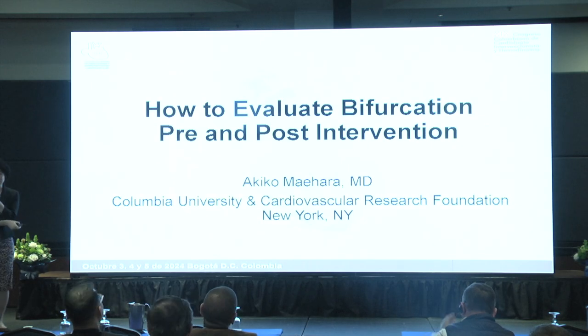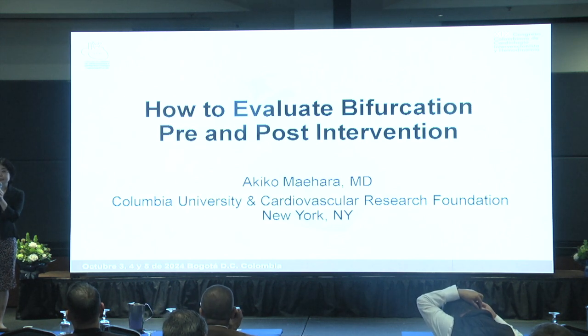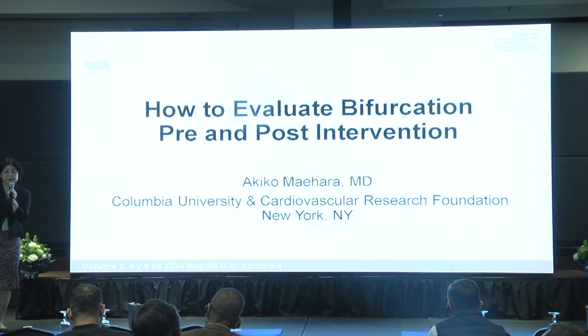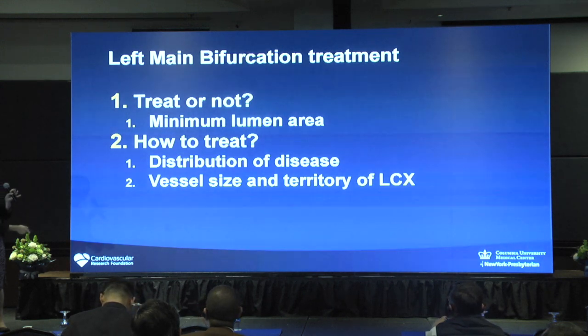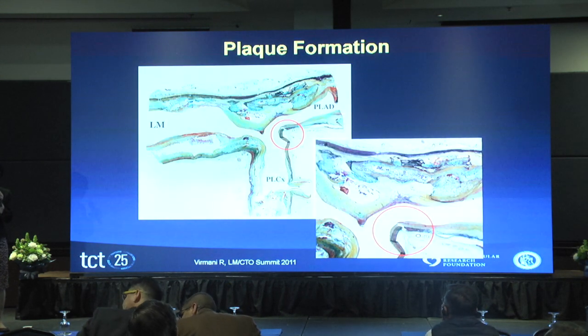This is talking about the bifurcation, but I didn't overlap too much. I really concentrate on left main bifurcation because that's the most important segment, and somehow important when we are talking about the bifurcation. So that's what I'm going to explain. I showed this picture already, but now I'm talking about the bifurcation.